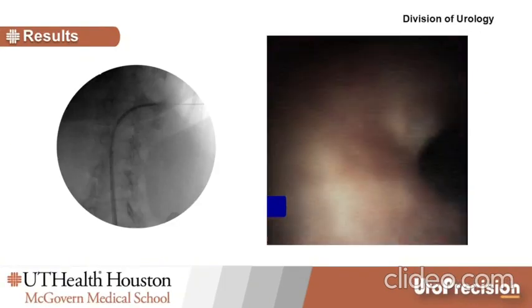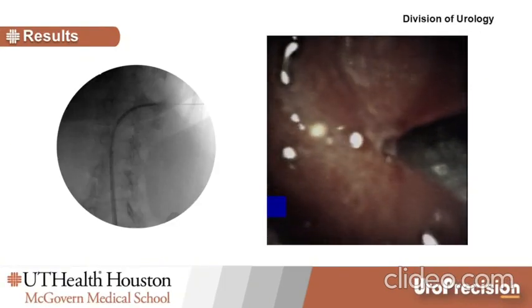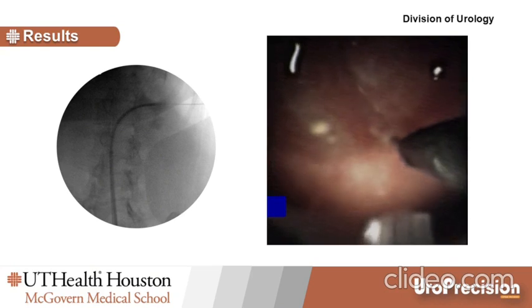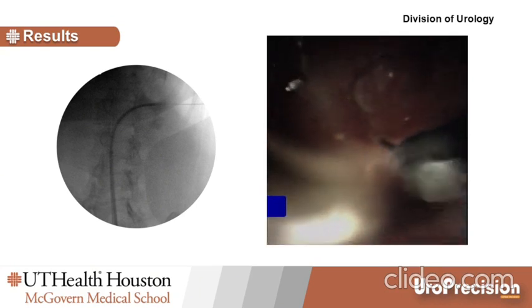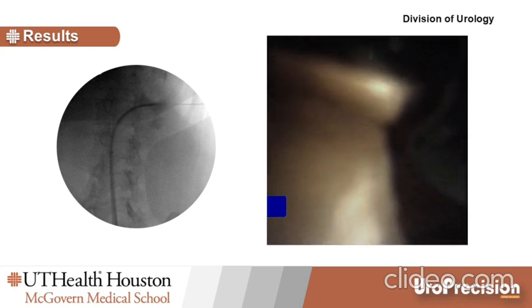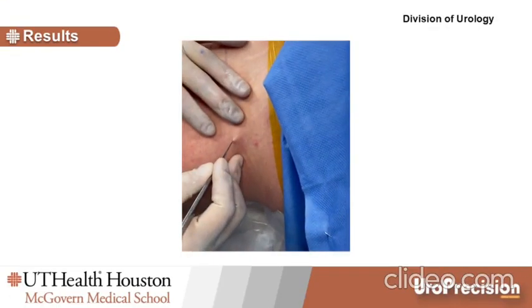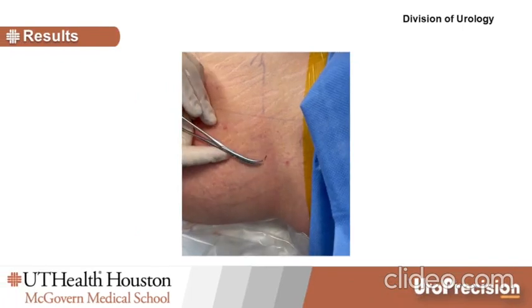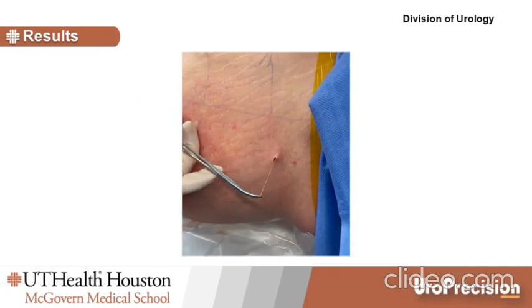Once the calyx is selected, we insert the Retroperc puncture apparatus through the ureteroscope. This allows precise control of the puncture under direct vision, an advantage over traditional antegrade approaches. Under fluoroscopic guidance, the puncture wire is advanced through the kidney until it reaches the flank. Gentle forward pressure creates a skin tent as the wire approaches the surface. Once the wire emerges, we clamp it to maintain stability.